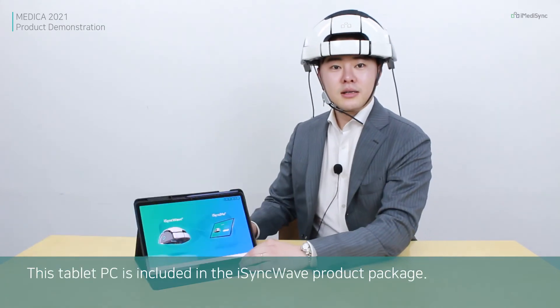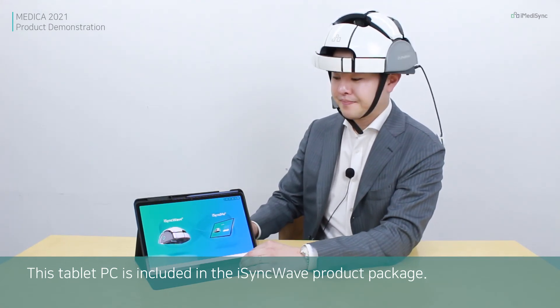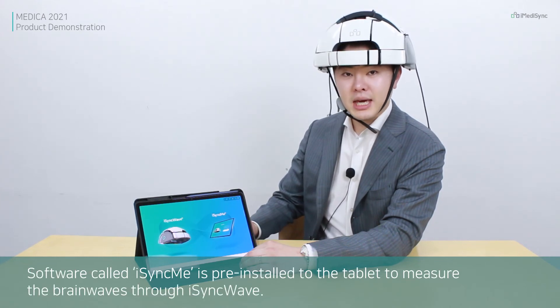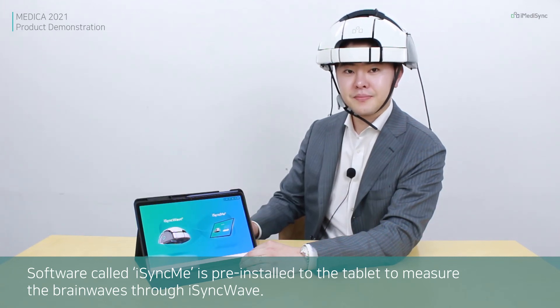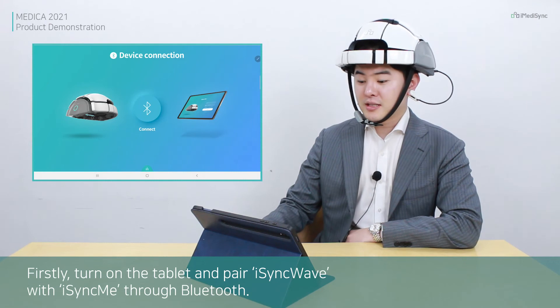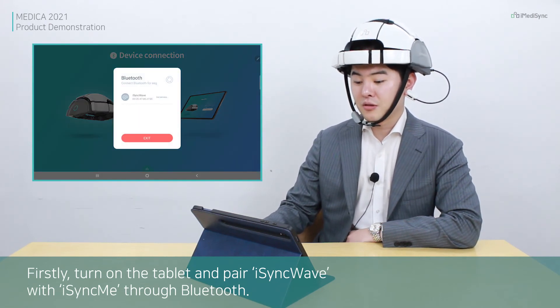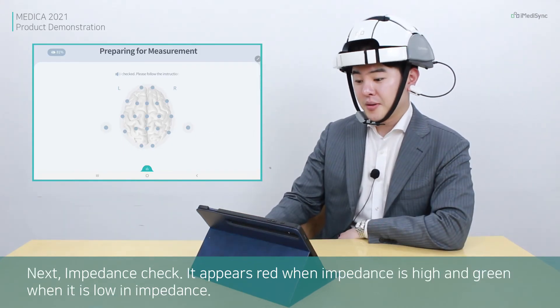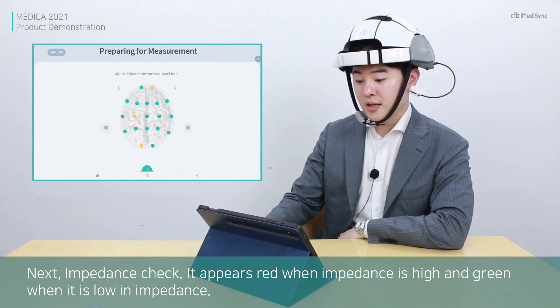This tablet PC is included in the iSyncWave product package. The software called iSyncMe is pre-installed on the tablet to measure brainwaves through iSyncWave. First, turn on the tablet and pair iSyncWave with iSyncMe. Next, perform an impedance check — it appears red when impedance is high and green when impedance is low.